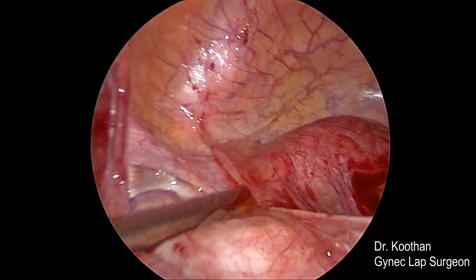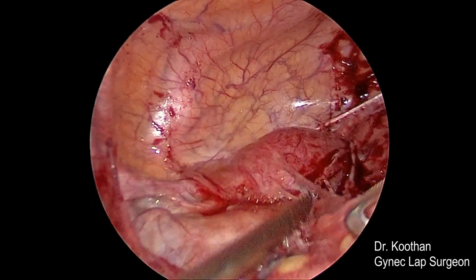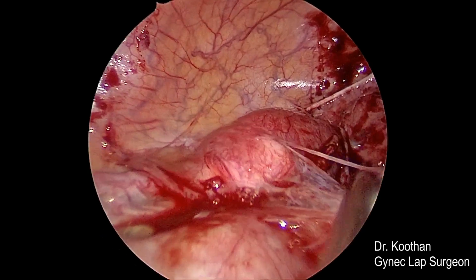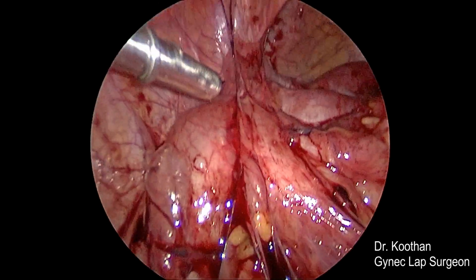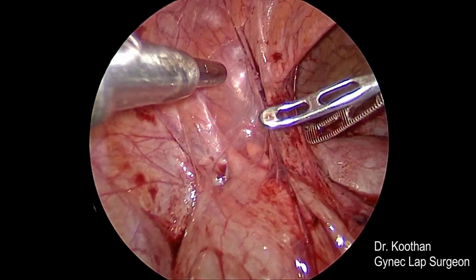Now you can see the round ligament, left side round ligament, and the mass which you are seeing right now is the left side Pyosalpinx, huge Pyosalpinx. These adhesions will cause a lot of neovascularization, so there will be a lot of newly formed blood vessels.